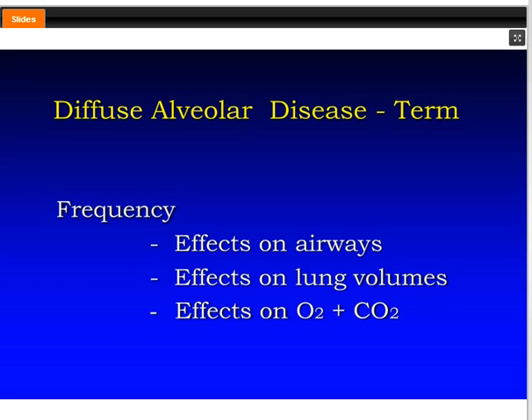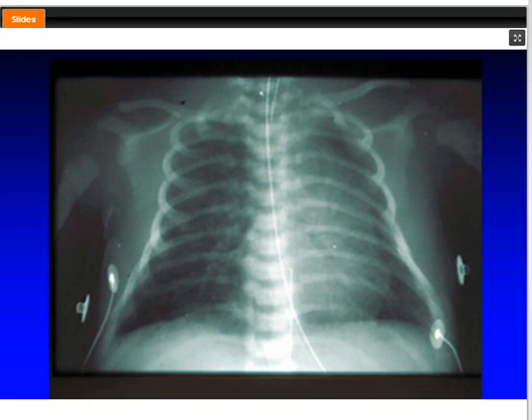From a frequency standpoint, again, you have a baby who has some pneumonic process, and somebody's decided, well, we use 15 hertz for everybody.